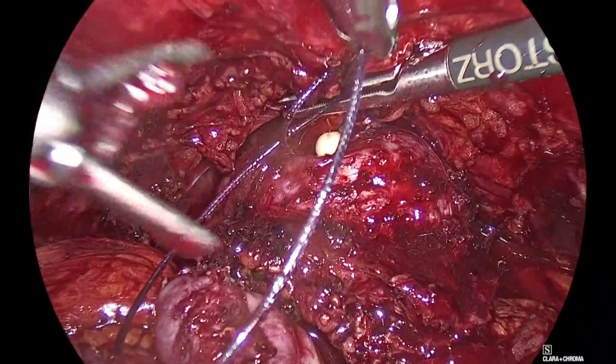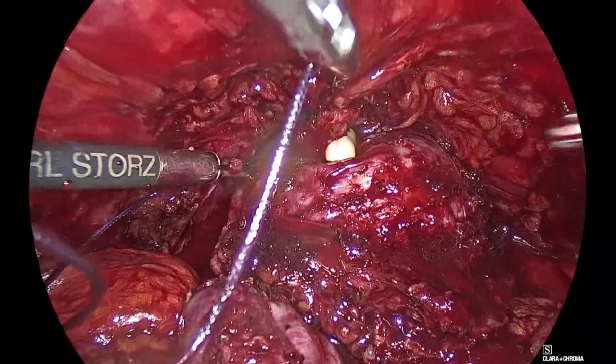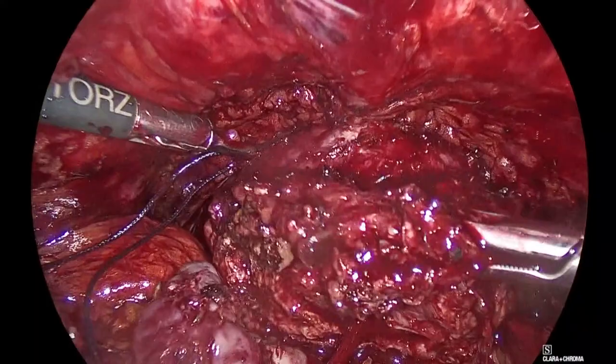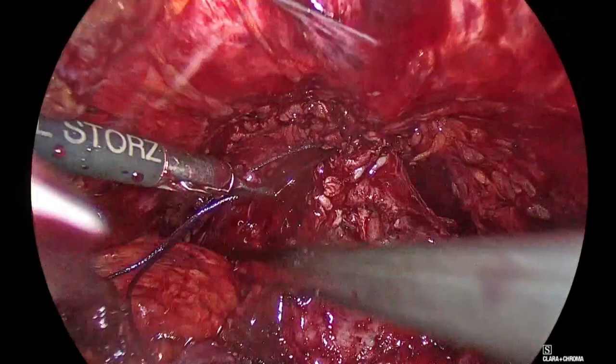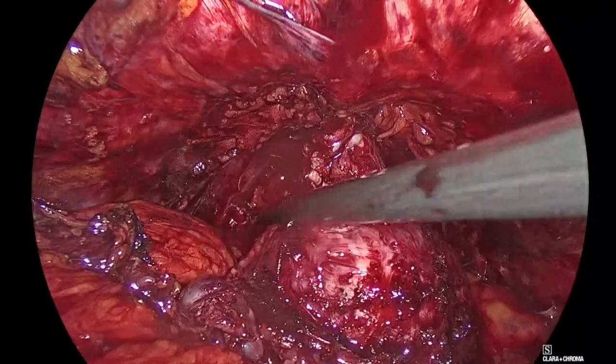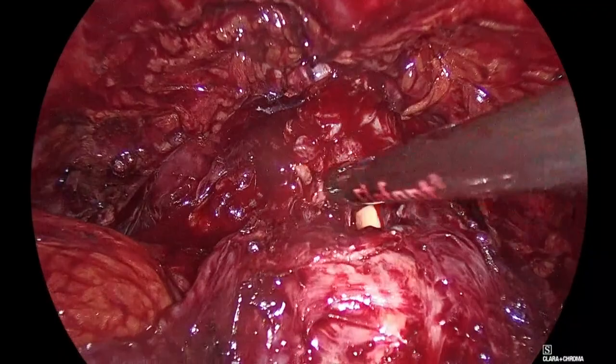Leave, Panagiotis. Leave. Good. Grasp the prostate, Panagioti. Harmonic. Down the prostate. So I think that now I'm not a fan. I know a lot of people do not want to suture the Santorini, but I'm reluctant on this. I have seen cases that have been transfused. And I think that the big advantage of laparoscopy and all these minimally invasive things is it's bloodless. We'll see it later on.